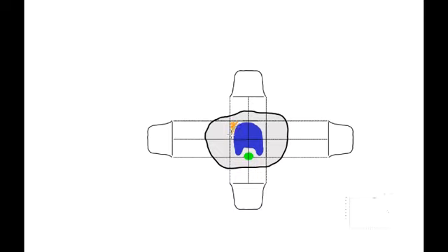So that's a challenge. With 3D conformal radiotherapy, what you would do is you put a beam on like this, and there's a beam profile, and it has a relatively even dose across the face surface of the beam. And so it's going to be high dose all the way across, uniform. And then in planning, you put on extra beams here. We've put on 4 beams onto this plan, and so you create this high dose region in orange throughout the whole box here. And you'll notice here that the high dose is over the OAR.